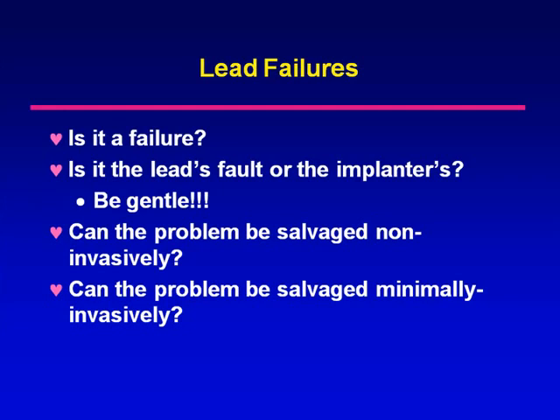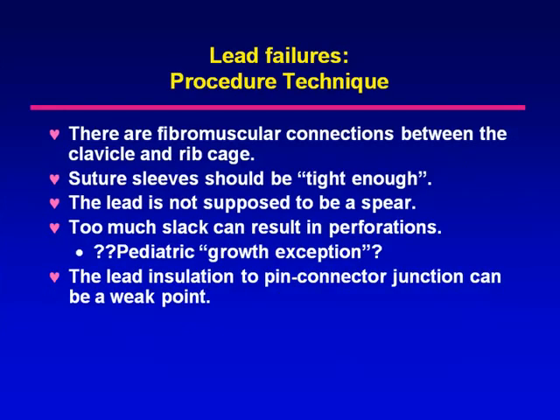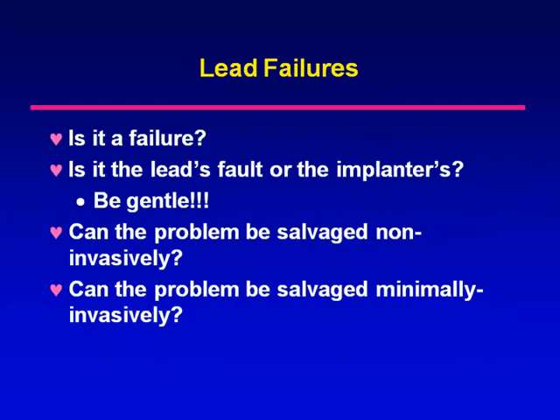And so the question of lead failures is, there are several. Is it really a failure? Is it the lead's fault or the implanter's? Can the problem be salvaged non-invasively? And it can be solved minimally, for example, by changing the device rather than changing the lead.